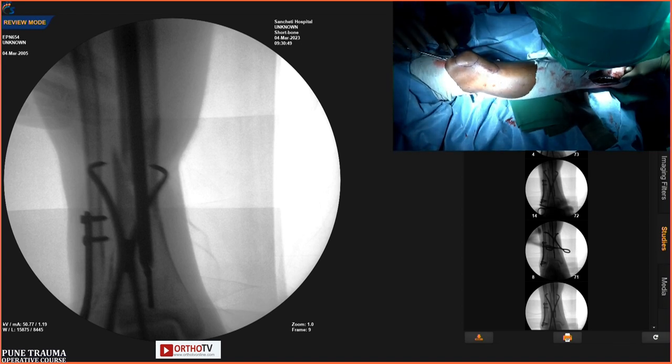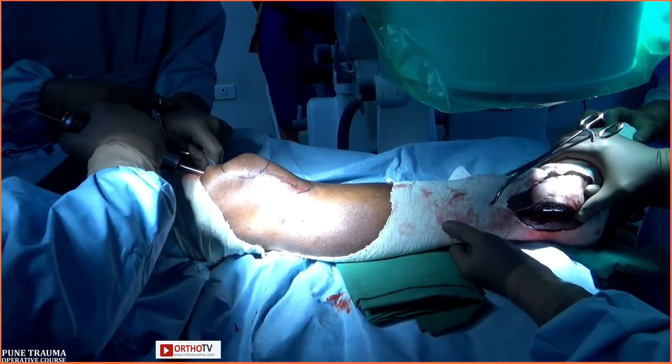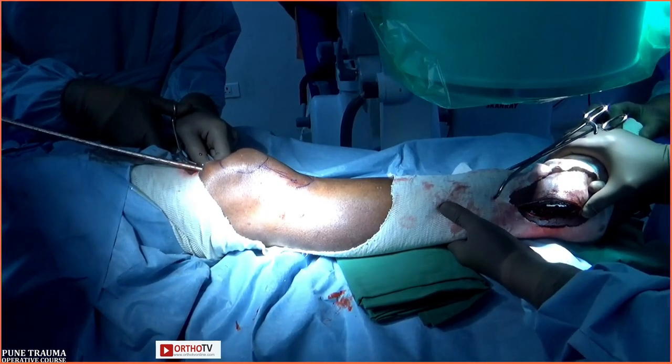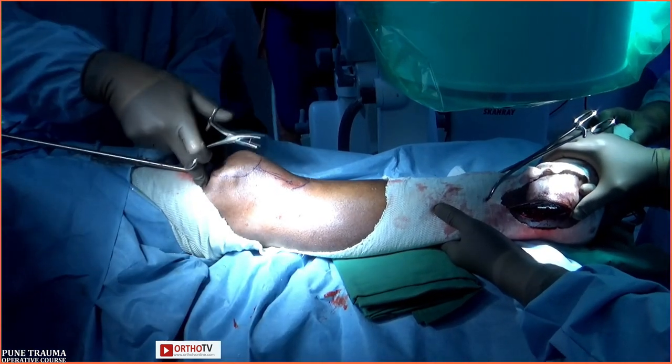There is one more precaution that you can see here. We have to support the fracture while doing reaming, and that is the most important. Otherwise, with the vibration of your reaming system, you may displace the fracture. So it is always better to hold the fracture while reaming by one of the assistants.